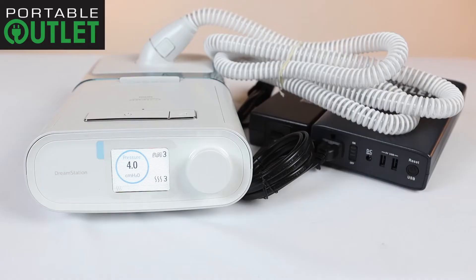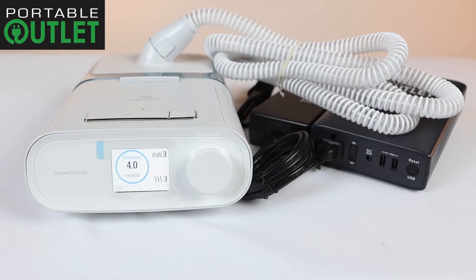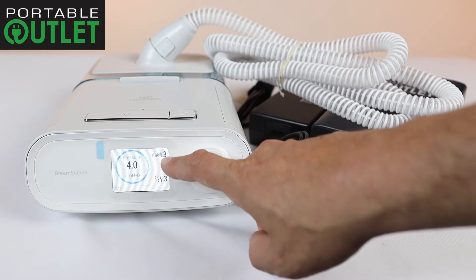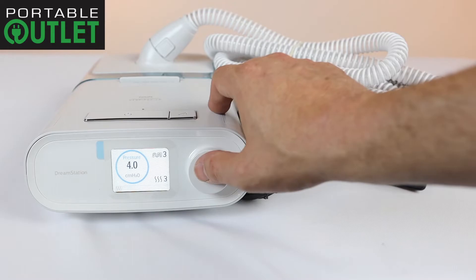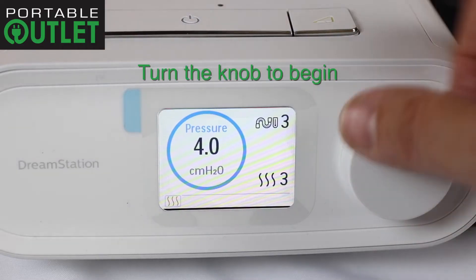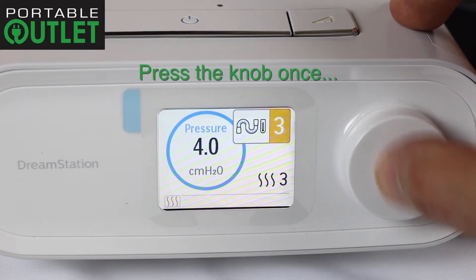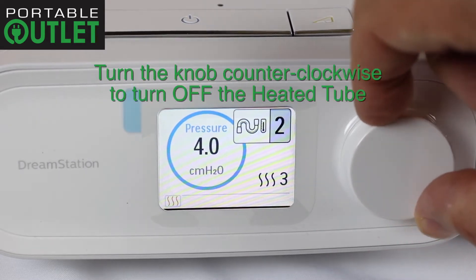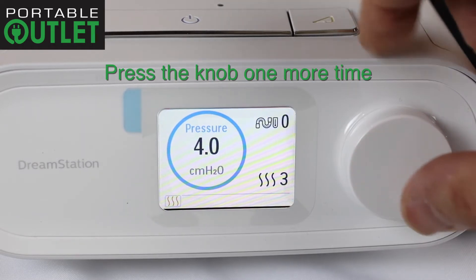If you are using the optional Respironics heated tube, you will need to turn off both the heated tube and the heated humidifier to maximize your CPAP battery life. When the device is on, you will notice the heated tube icon and heat setting in the upper right corner, and the steam icon indicating the humidifier setting in the bottom right corner. Turn the knob to activate the screen, then press the knob in one time, rotate the knob counterclockwise all the way to zero, then press the knob again to turn off the tube temperature.